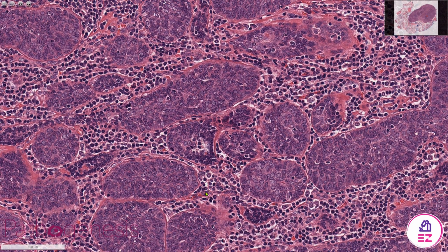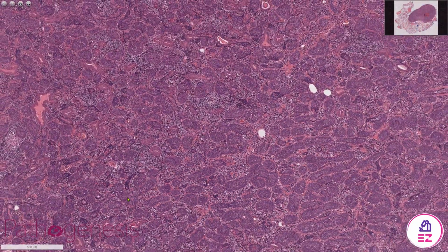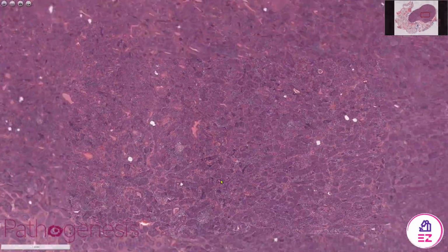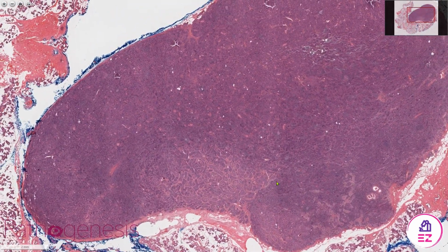And often, to distinguish a basal cell adenoma from adenocarcinoma, you can only really go on whether it's invading the surrounding tissues, because the cytological changes are sometimes very minor between the two. So this was a basal cell adenocarcinoma.